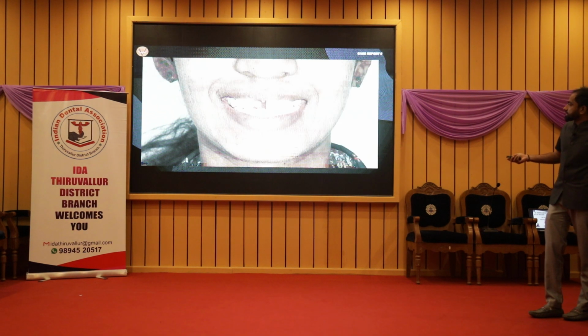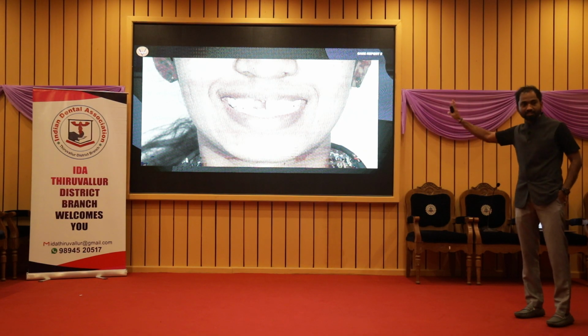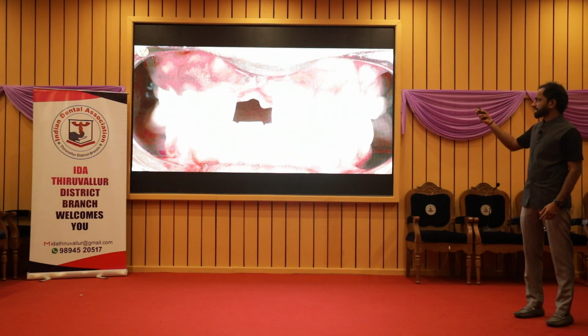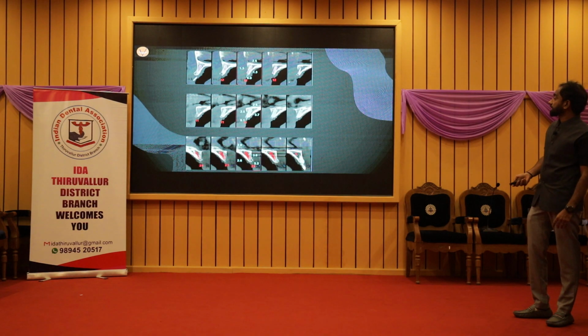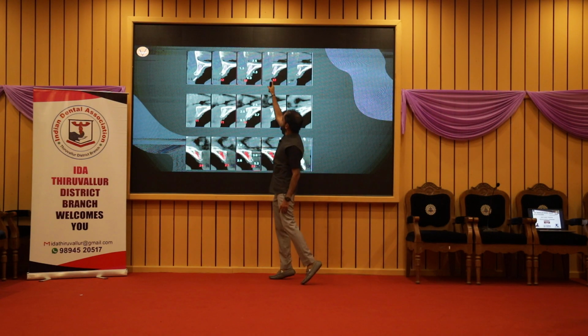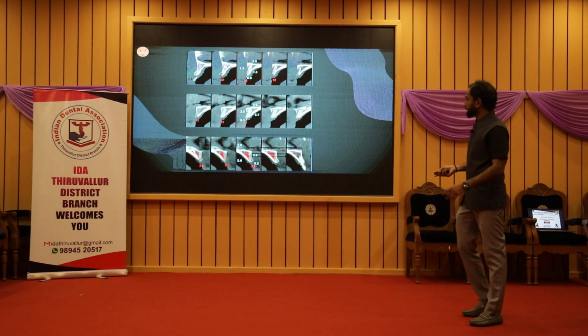And the next case is an ST3. I don't have registration for this. I did this case just 2 weeks back, because I put it directly from the memory card into this. And this is a consultation case. It's not my clinic case. I went for a consultation, and this is how the gingiva is. And this was a CBCT plan. You can see that it is a little thin. It is not able to receive that big an implant.